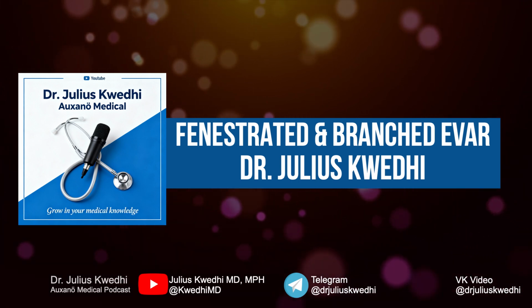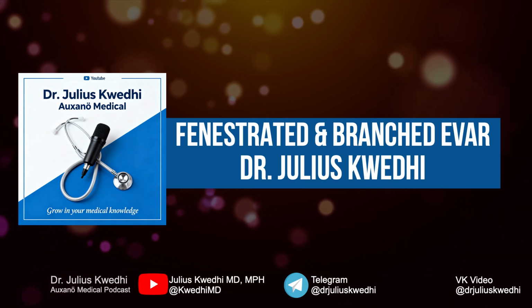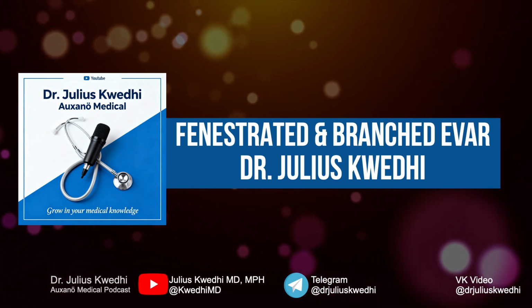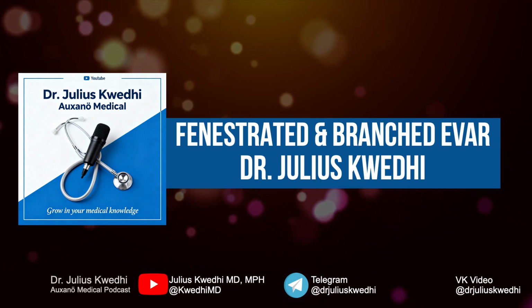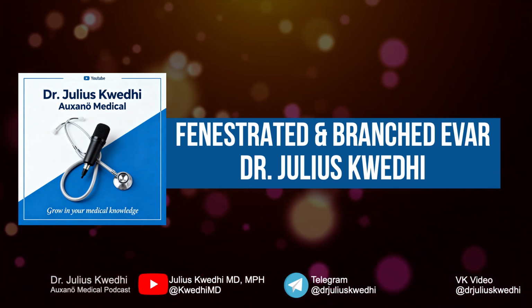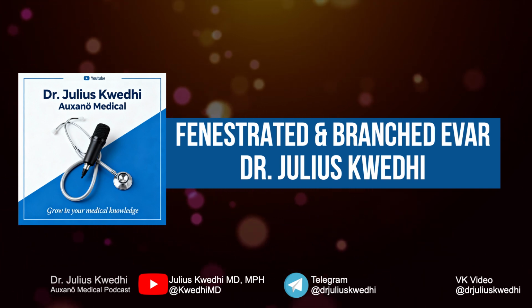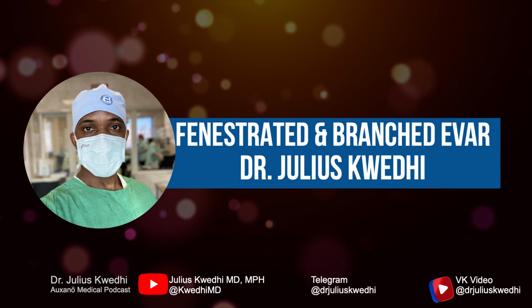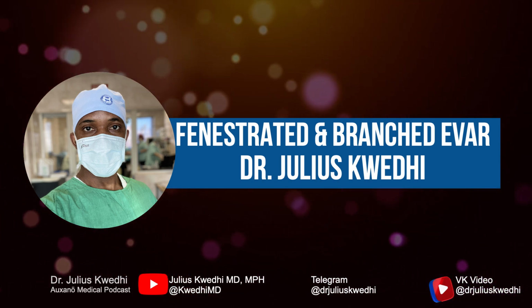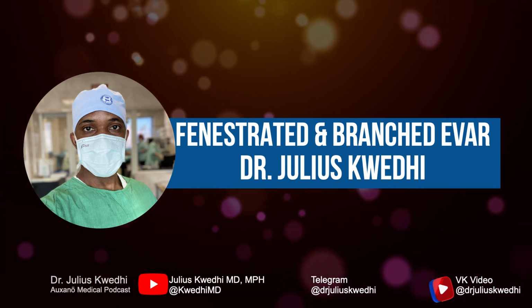The procedure is performed in a hybrid operating room or advanced angiography suite with high-quality imaging, preferably with fusion capabilities. We typically use general anesthesia, though carefully selected cases can be done with regional techniques. Arterial access is obtained, usually bilateral femoral, with brachial or axillary access for branch devices. Large bore sheaths are necessary, often 18 to 24 French, for the main body delivery system.